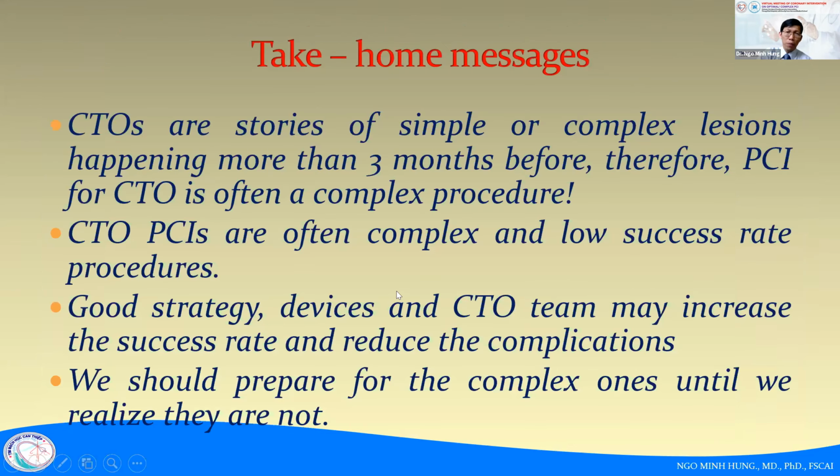So this is the take-home message from my presentation: CTOs are the story of simple or complex lesions happening more than 3 months before. Therefore, PCI for CTO is often a complex procedure. CTO PCI are often complex and low success rate procedures. Good strategy, devices, and a CTO team may increase the success rate and reduce the complications. And we should prepare for the complex ones until we realize they are not.